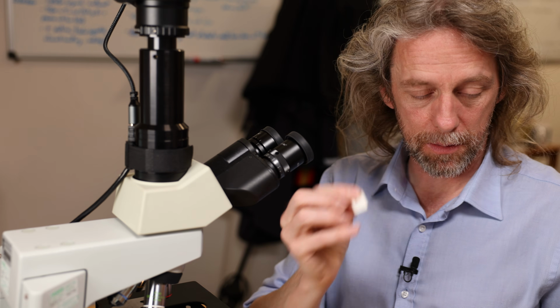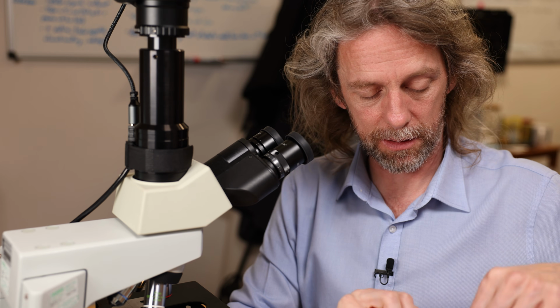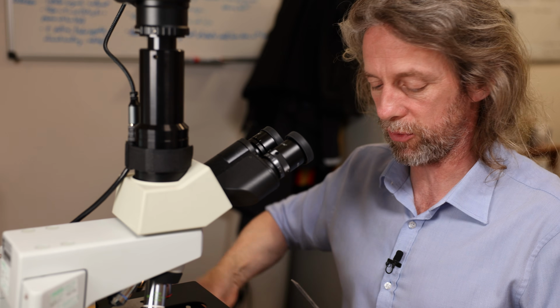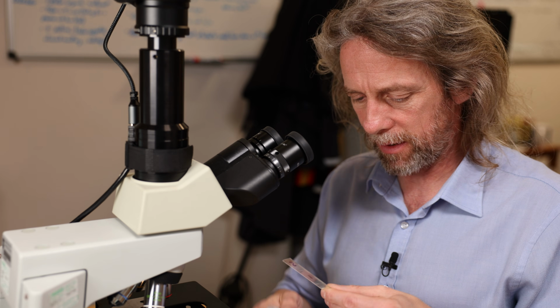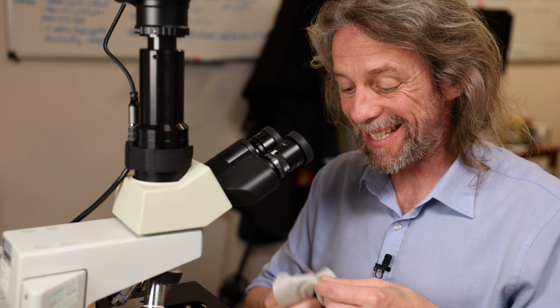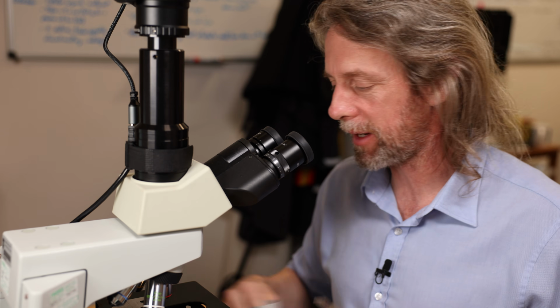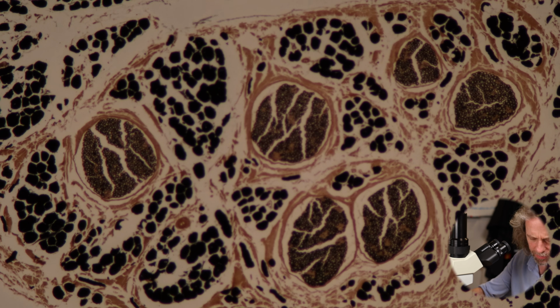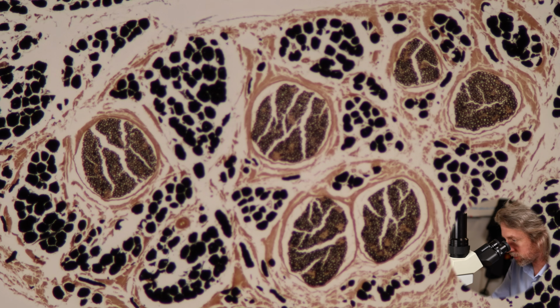Now, that section of the sciatic nerve was stained, like I say, with Masson's trichrome, which let us see a whole bunch of structures. This one, I think, is stained with osmium tetroxide. What this is doing is it's staining the fat black. So when we look at this, this should look similar but different. Look at that. Oh, wow, that's a really interesting image, isn't it? What on earth are we looking at here?